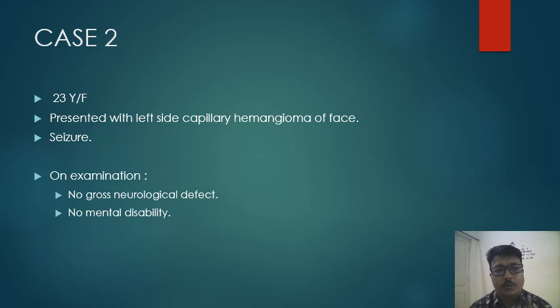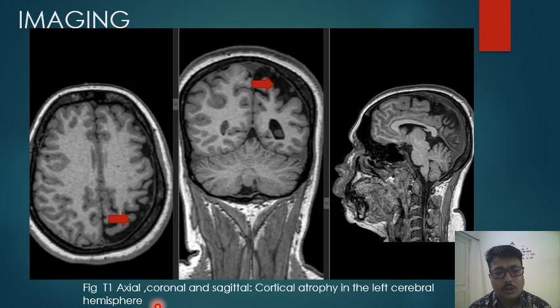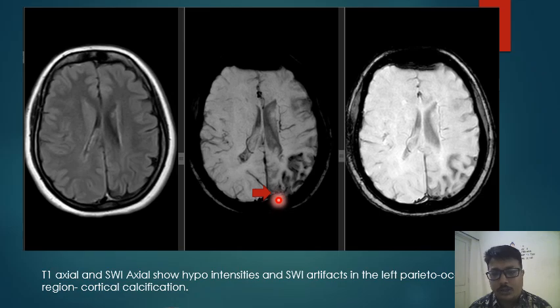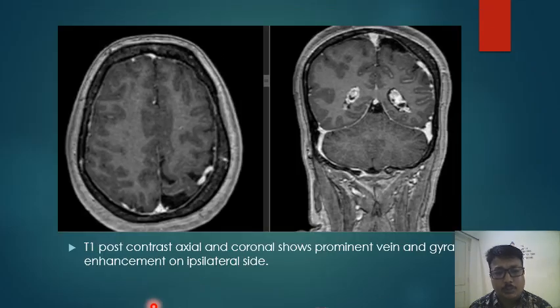Case 2 is a 23-year-old female who presented with left capillary hemangioma of the face. She also presented with seizure, and on examination there was no neurological deficit; mental disability or mental retardation was not found. Imaging showed T1 axial, coronal, and sagittal sections demonstrating hemiatrophy of the left cerebral hemisphere in the form of prominence of the sulci. Susceptibility weighted imaging shows signal dropout in the left occipital region signifying calcification, identified by the red arrow. Post-contrast axial and coronal images show prominence of veins and gyral enhancement on the ipsilateral side.